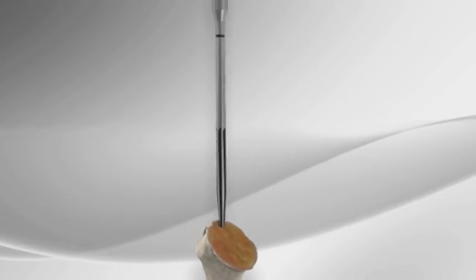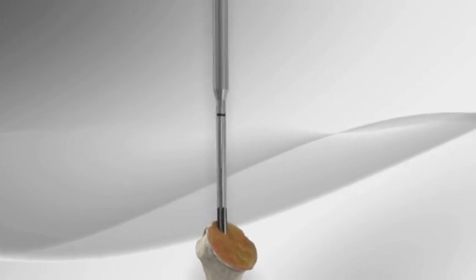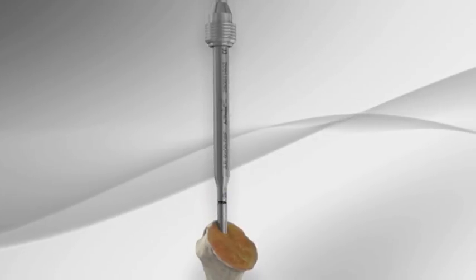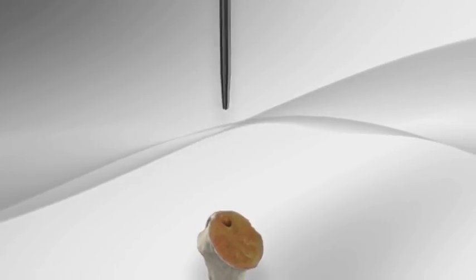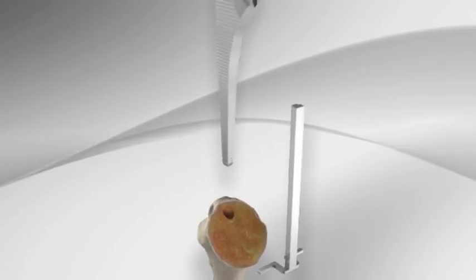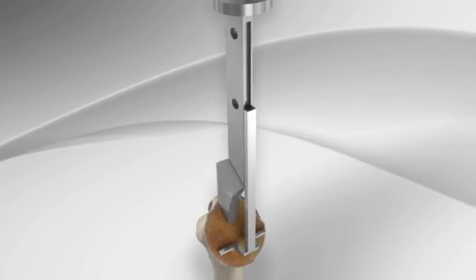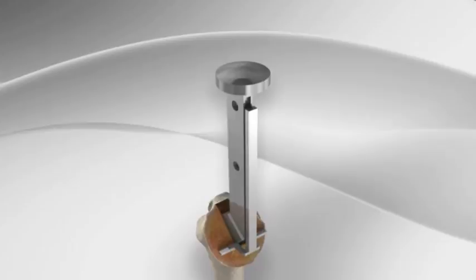A wide drill or reamer is used to make holes that extend from the cut surface of the bone to the center of the humeral shaft. A punch is then inserted into this hole and is used to create room for the prosthesis.